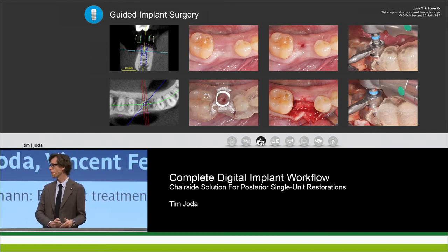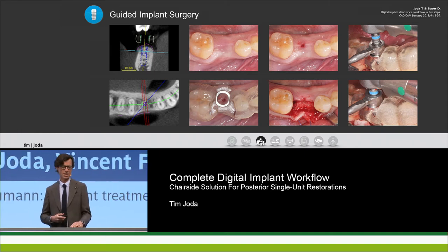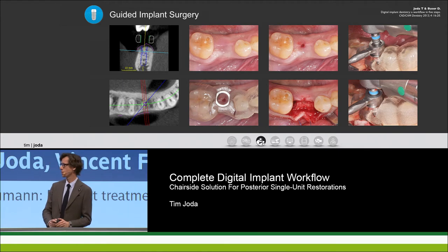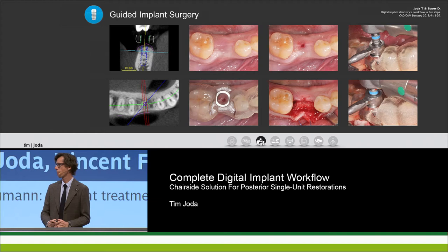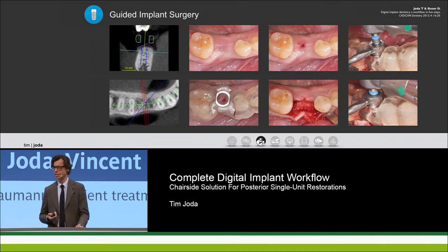Gary, as an expert in surgery and implant dentistry, do you agree with this three-dimensional positioning of the implant? Yes, absolutely. I think here you are meeting the expectation and requirement from both the surgical and prosthetic side — I would not change anything about it.